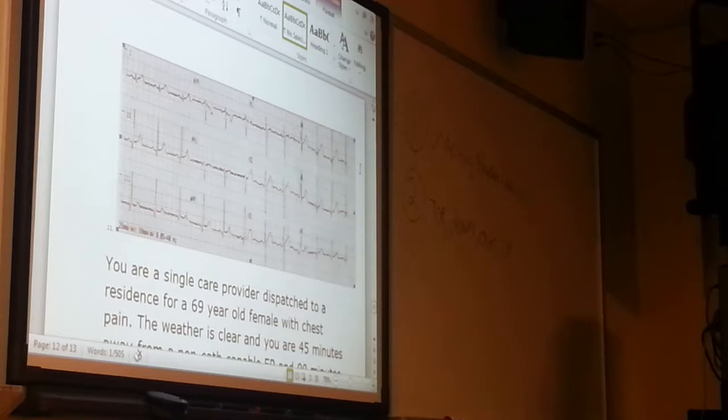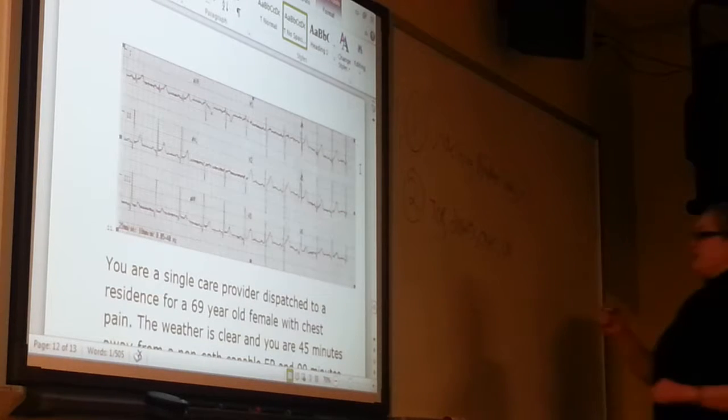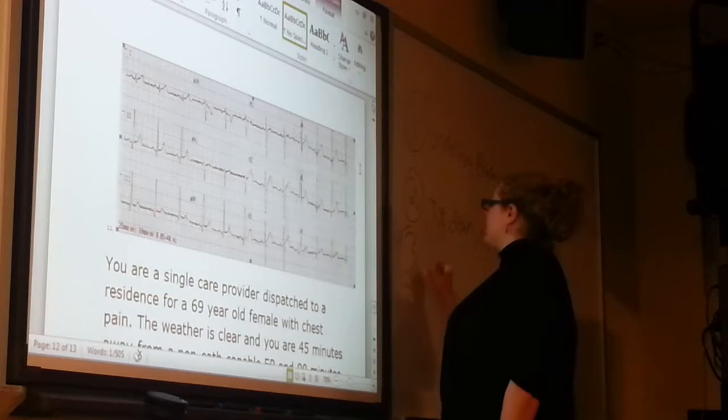Okay? And basically what happens is that it's not beating as it should. It's also not conducting as it should. This is important to know because you cannot diagnose ST segment elevation through LVH. You could see ST segment elevation everywhere. And if you have a left-sided bundle branch block or you have LVH, we call them mimics. I'm going to write this down.